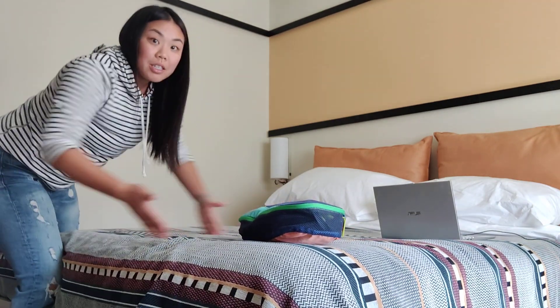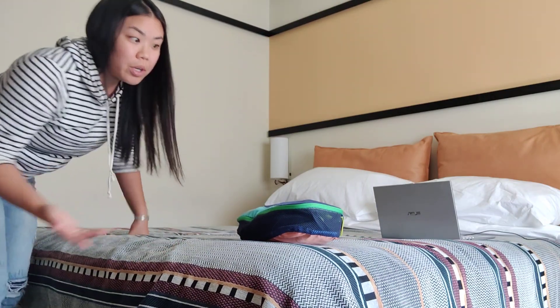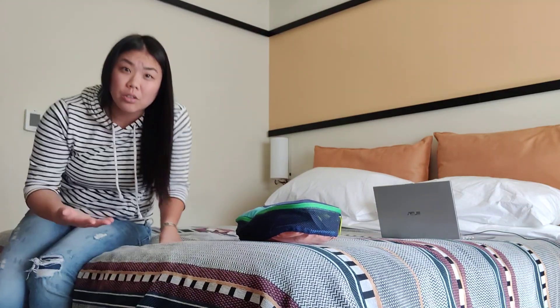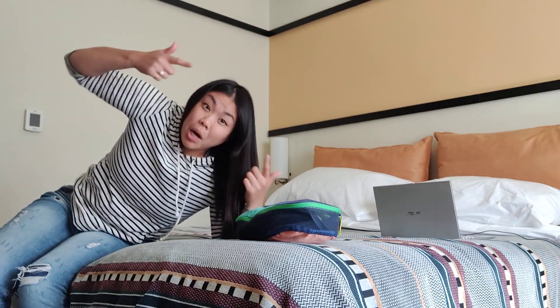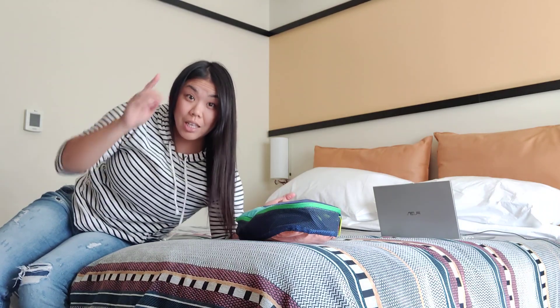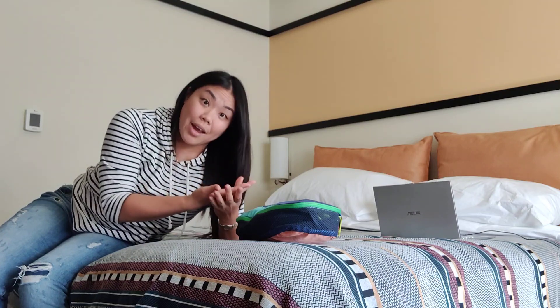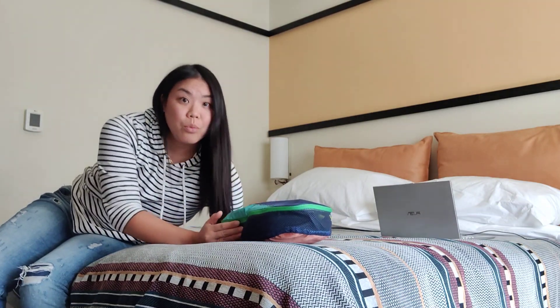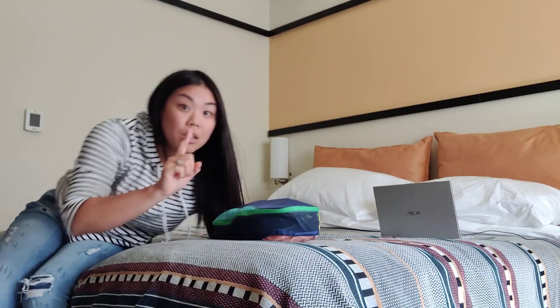I always like to demonstrate before the patient gets on the table, because this is probably the patient's first time positioning for a wrist or hand scan. They're not going to know what a Superman position is, so if you explain it to them first — have a towel or something to show them — it helps a lot.